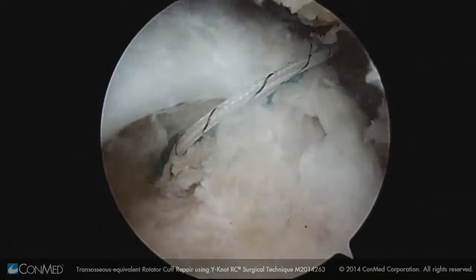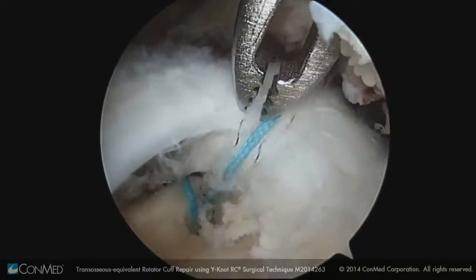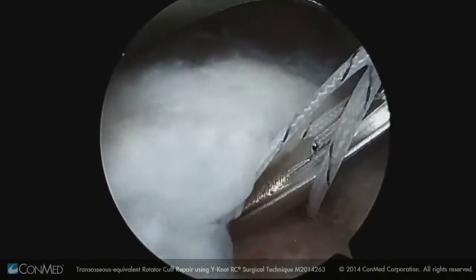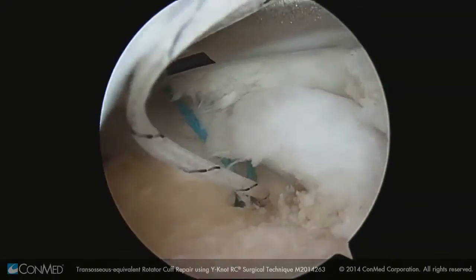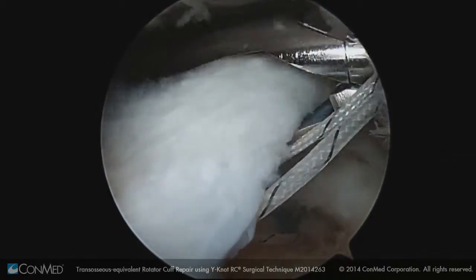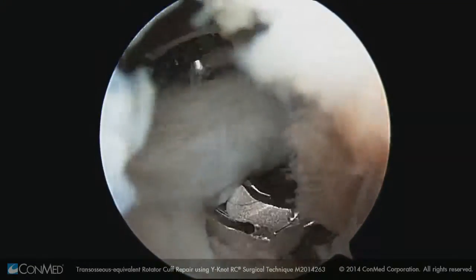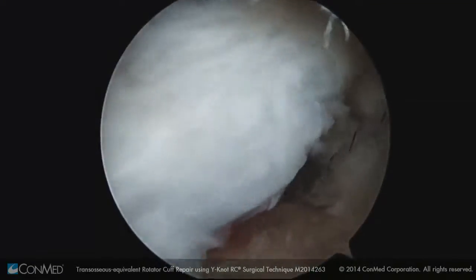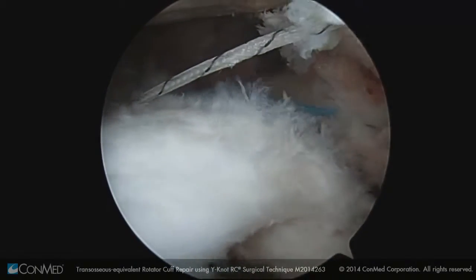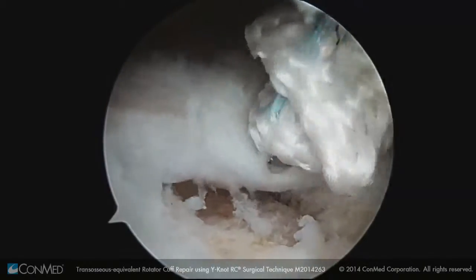Subsequently, we're going to pass the sutures from the Y-knot RC using a standard antegrade needle punch device, and we are simply selecting and passing these in a mattress fashion through the full thickness of the rotator cuff. One wants to make sure that if there is delamination that both lamina are captured with this medial row. This is a double-loaded Y-knot RC. There is a triple-loaded variety as well, but with the transosseous equivalent technique, I will typically only use a double-loaded anchor.